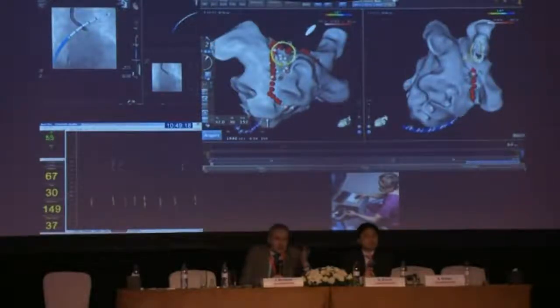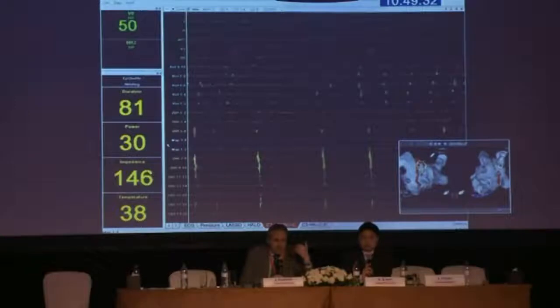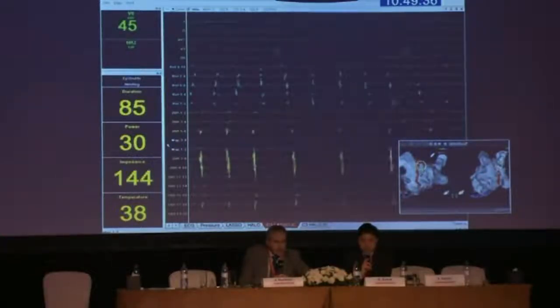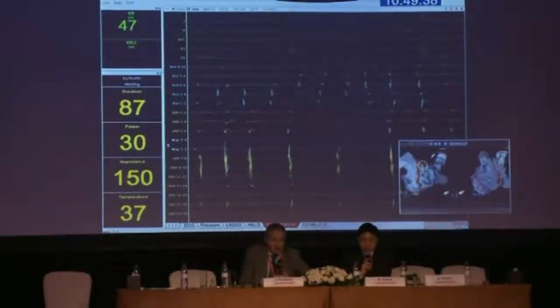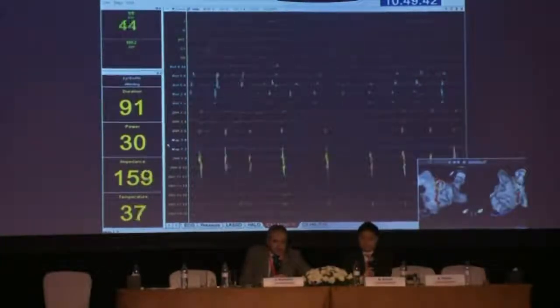It's a little bit more difficult sometimes to visualize certain parts because it's a metallic sheath, so you have more stuff in the septum, but otherwise, there are ways how to avoid this. You can go higher, or you can go even to the coronary sinus with the ice catheter. You can see that signals are a lot less busy in the vein now. We're getting close. So you are doing something.